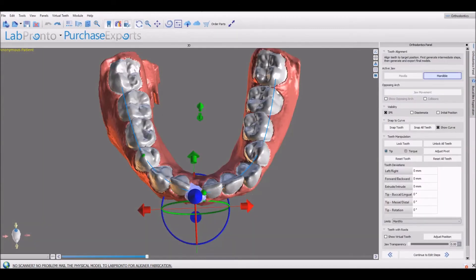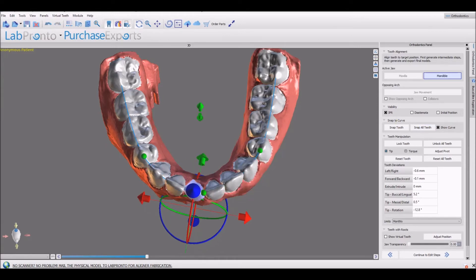We have improved the snap to curve functionality in the ortho module in order to remove IPR around the entire arch.